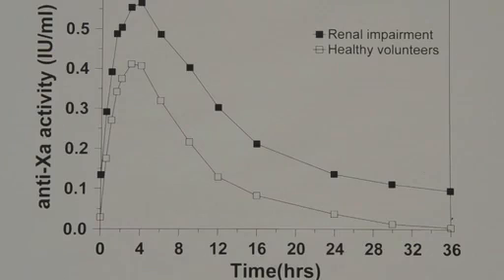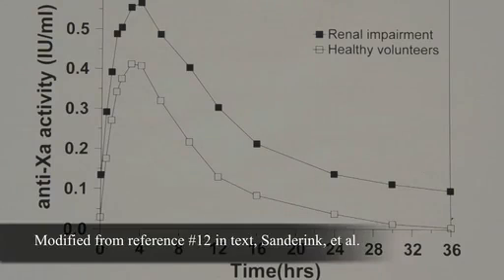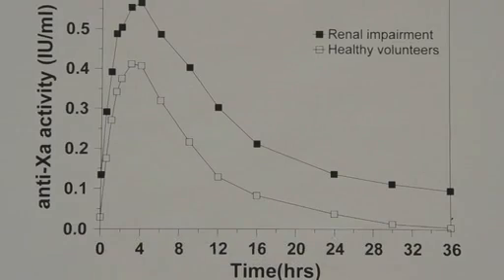By way of introduction, we refer here to published work on the time course of the plasma levels of the low molecular weight heparin, enoxaparin, in human subjects. We are demonstrating today our results with a rapid point-of-care assay for low molecular weight heparin. In this case, the entity is enoxaparin.